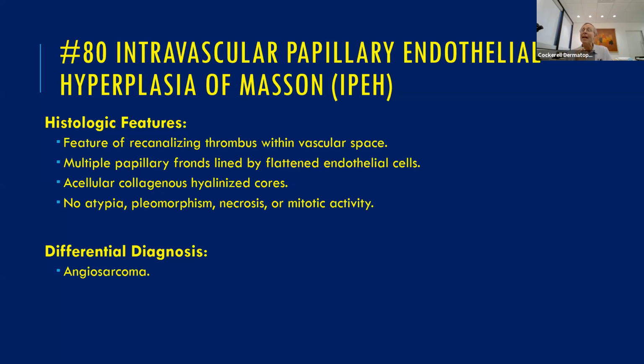It happens more in that condition for some reason than it does in patients that have circulating cryoglobulins and that sort of thing, where they get more of a vasculitis. And the other setting where we see this is a patient with stasis alterations, stasis changes. Low-grade ischemia, they get livedovasculitis-like changes associated with stasis dermatitis, and with stasis ulcers. They get prominent vascular proliferation, but they get fibrin clots inside the blood vessels, and they get the secondary vascular proliferation that occurs secondary to that as well.